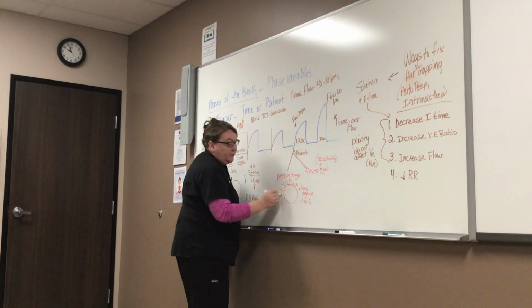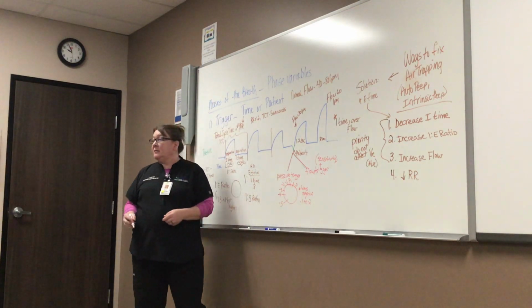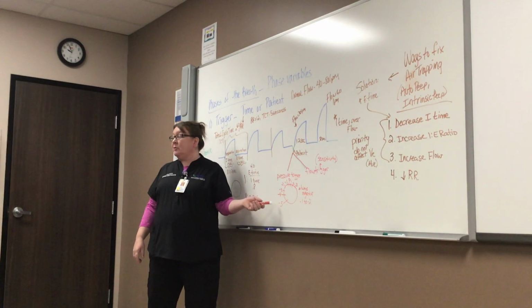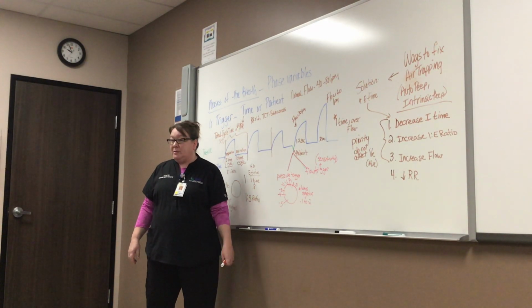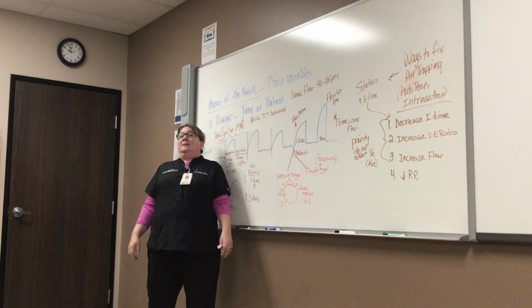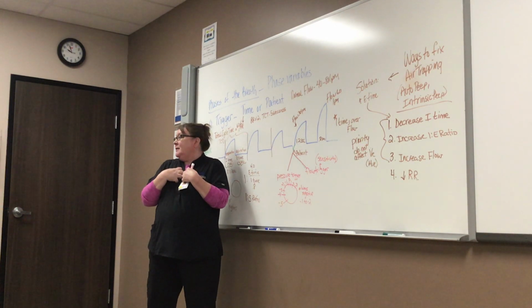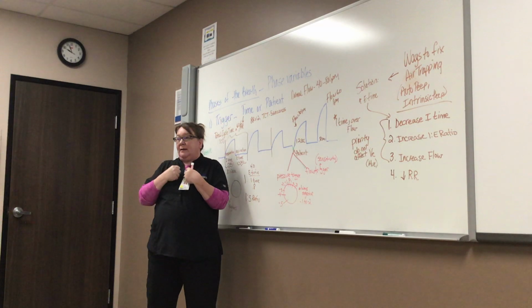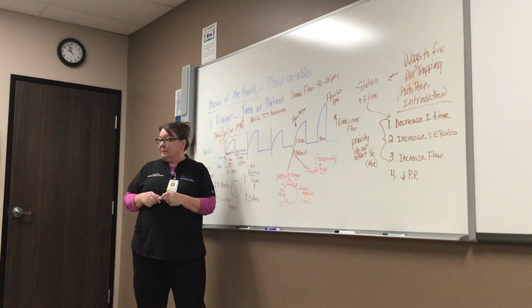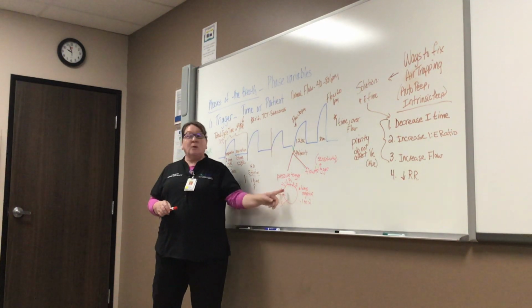If you set it all the way back to -5, what's going to happen? Patient will never get a breath because they can't pull that back that far on a vent, or if they are, you'll see this extreme chest movement, almost going concave, because they're trying to pull so hard and can't get it. So your patient will look very uncomfortable. Is that centimeters of water pressure? Yes, it is. Pressure is centimeters of water. So -1 to -2.